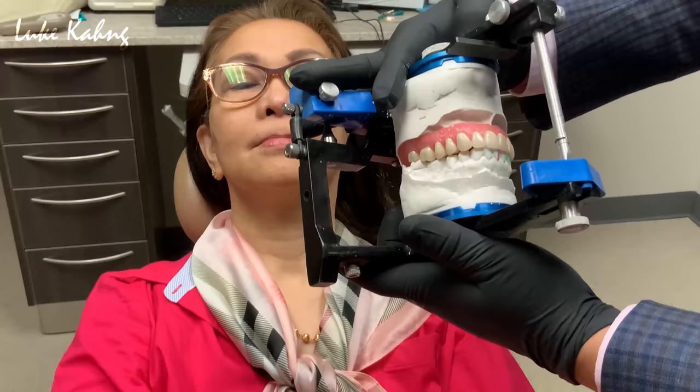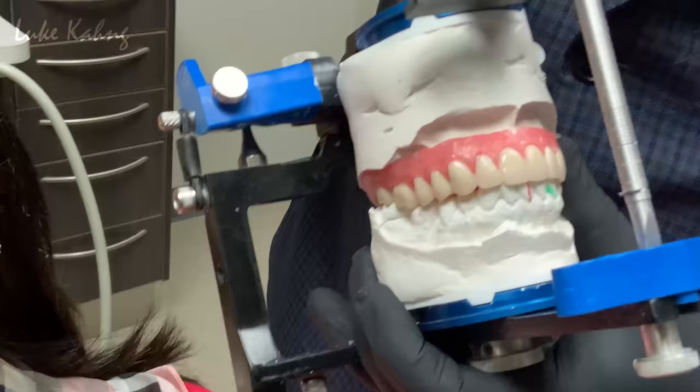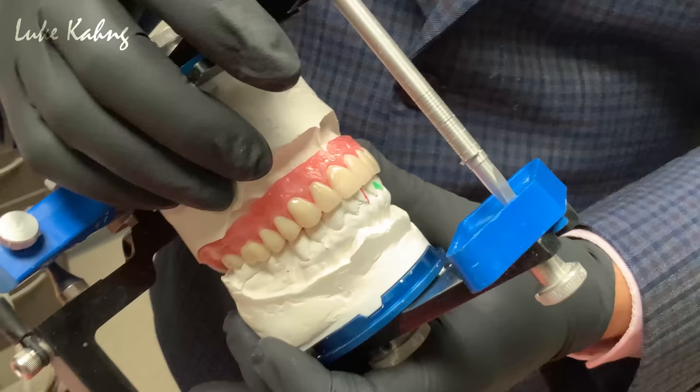Yeah. So there are two things that we're gonna do today. We're gonna try this in today, all right? This is just like as if she was in my office. We would try this in. But another thing that's very important that we do, I always, always customize my gum tissue color. That's why people come from very, very far places to come see me, from hours or other states, because I will actually give them a custom gum shade. Okay, and I always communicate the characterizations with Luke.